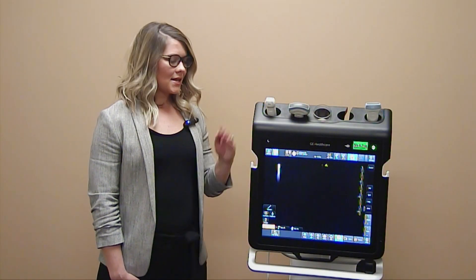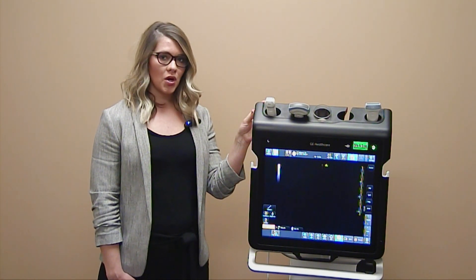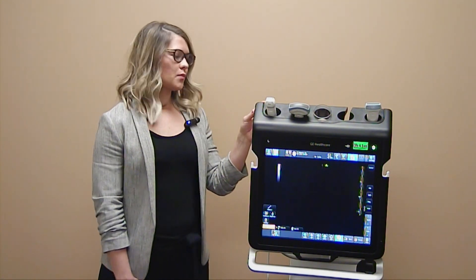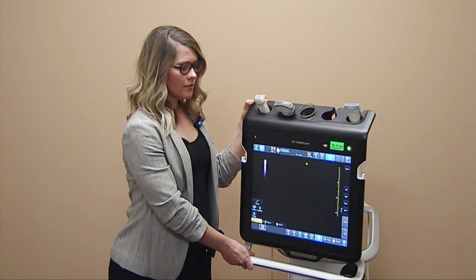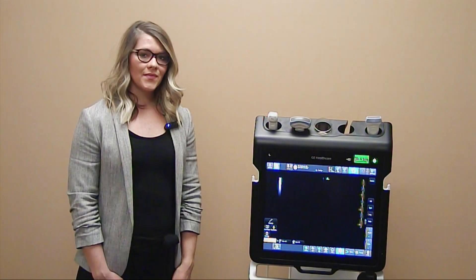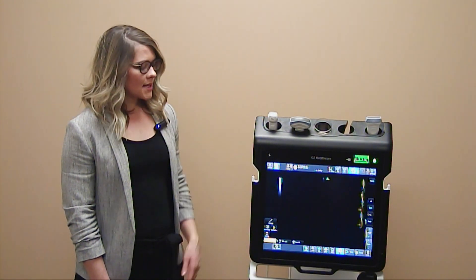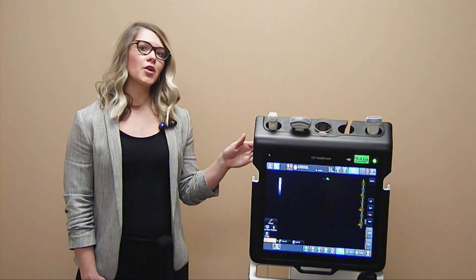The Venue has a 19-inch display monitor with an articulating arm. This enables you to move the monitor from side to side and up and down. The monitor also has a seamless touch screen display, which enables thorough cleaning.